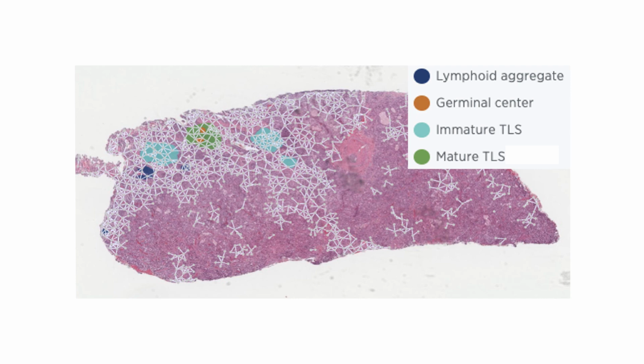We also found that features other than lymphocytes, for example, plasma cells, can be important for these gene expression predictions. This provides us with a lot of space for hypothesis generation in terms of what regions of the slides or what biological features actually contribute to this gene expression.